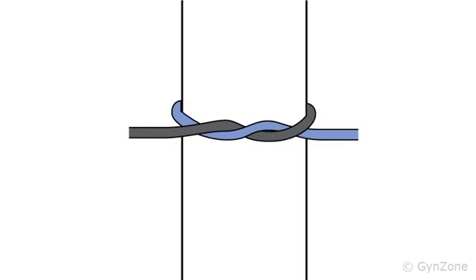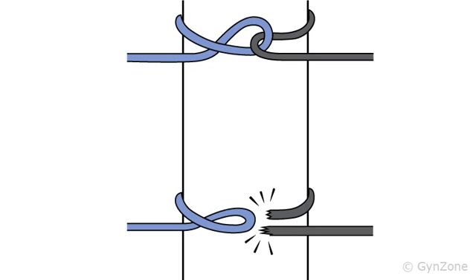To tie a proper knot, pull the thread flat against the tissue. This way you follow the direction of the stitches. Otherwise, the suture may lose tensile strength and break, as shown in the illustration.